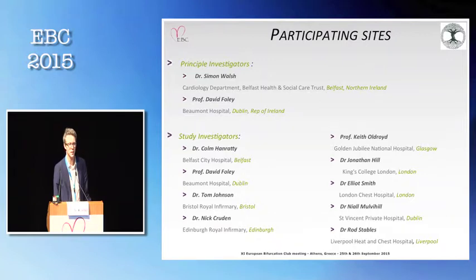And the hypothesis, when first proposed a couple of years ago, was the concept that modern generation drug-eluting stents should facilitate good clinical outcomes in planned 2 stent bifurcation treatments. The anticipated outcomes were that bifurcation Culotte stenting would demonstrate better outcomes than those published in the randomized controlled trials, and the hope was that by examining 2 up-to-date platforms, this could be demonstrated.